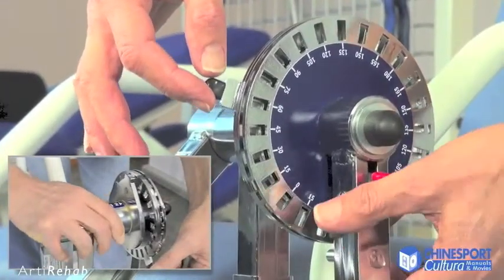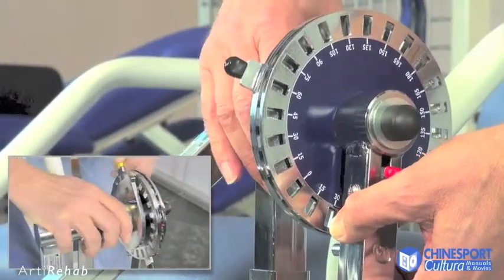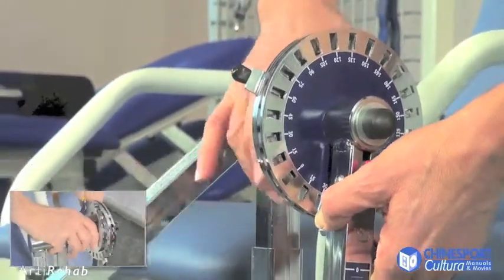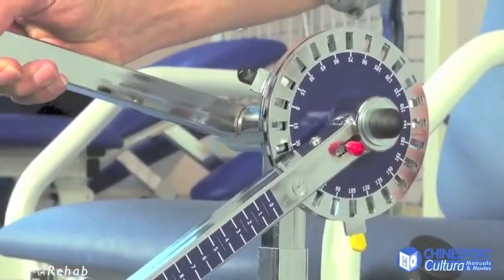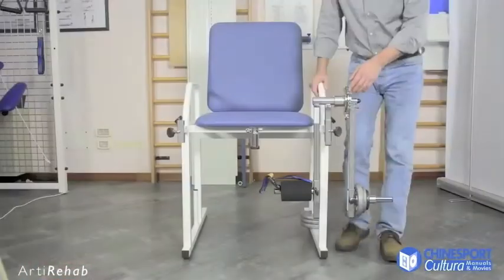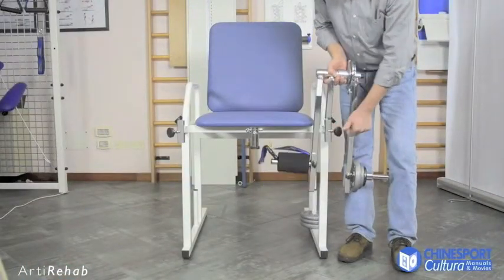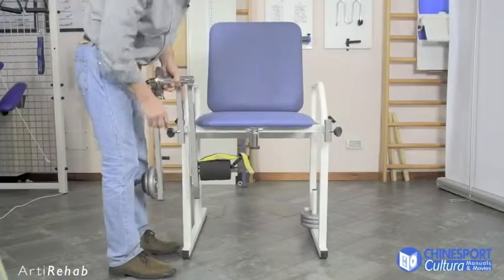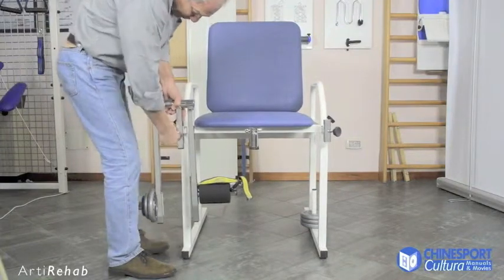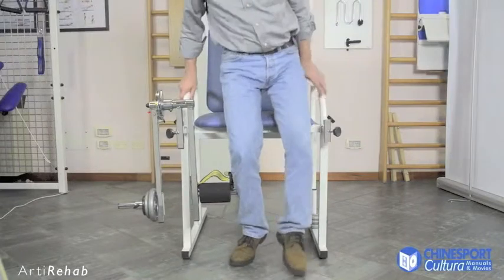When these settings have been done, it is possible to once again lock the system at the set starting and completion angles. The moveable arm can also be moved for use on the other limb, and the range of movement is adjusted again in order to precisely reproduce the work done with the other leg.